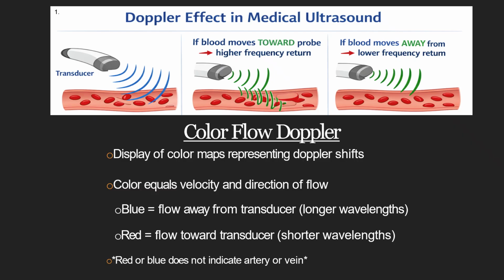So in the last slide, I mentioned using color flow Doppler to figure out which of these structures are arteries, which ones are veins. Basically, this tool is just a way to determine directionality of flow. We've all probably been on the side of the street, had cars or an ambulance go by us, or remember that question in physics in college or studying for the MCAT. As an object moves past us, the sound actually changes. Blood is kind of the same way. It's moving past that transducer and it's changing the frequency of the returning signals the transducer is picking up.